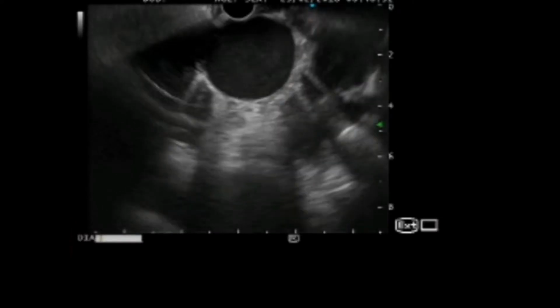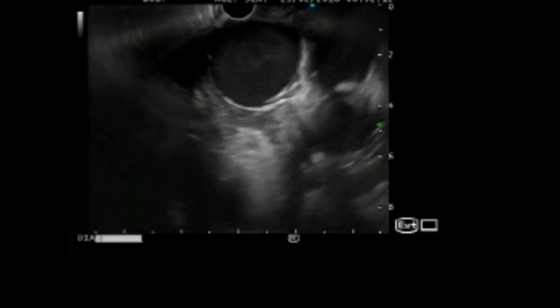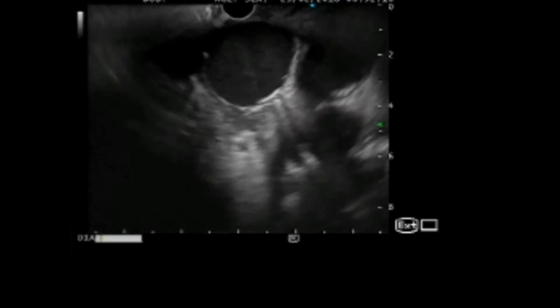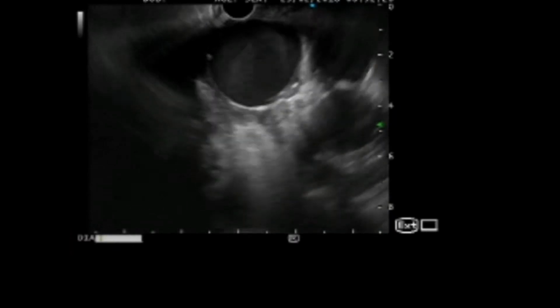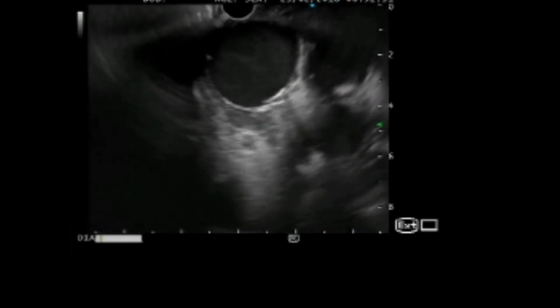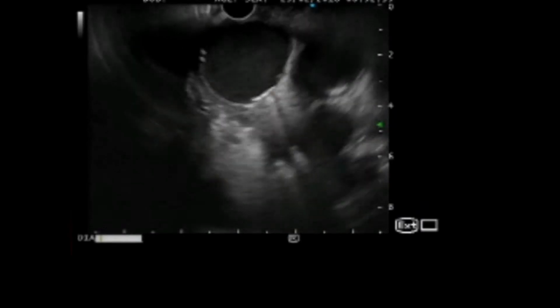This video covers the endoscopic ultrasound guided technique of coil and glue injection of a bronchial artery aneurysm in a symptomatic patient. After using the Doppler, you confirm the target lesion. You can appreciate the turbulence of the blood flow. Here is the mediastinal aneurysm arising just adjacent to the arch of the aorta from the descending aorta. It measures 3.5 to 3.4 centimeter.